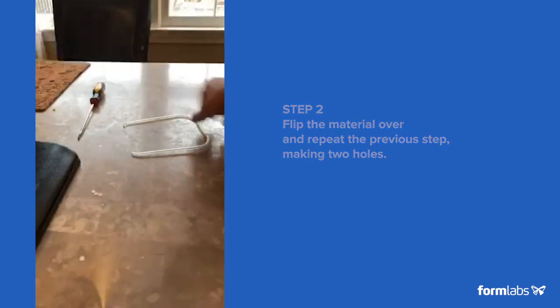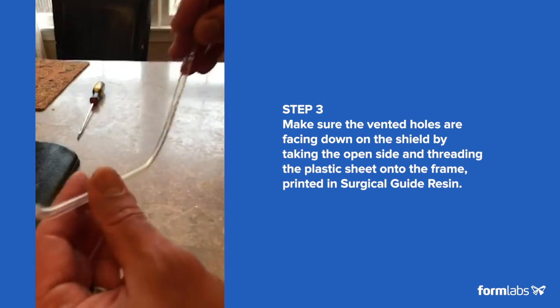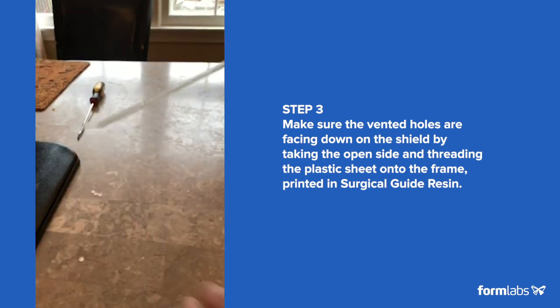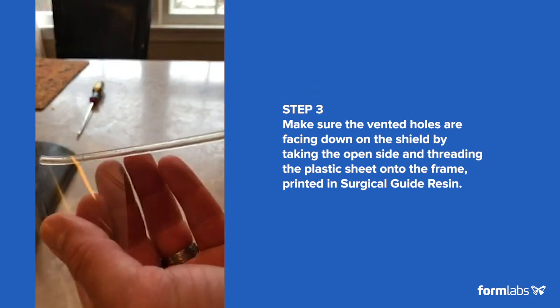The trick now is to make sure that the vented holes will be facing down on the shield and will be inside. So the easy way to do is get the open side, and then when you get the transparency, you just do this configuration here.